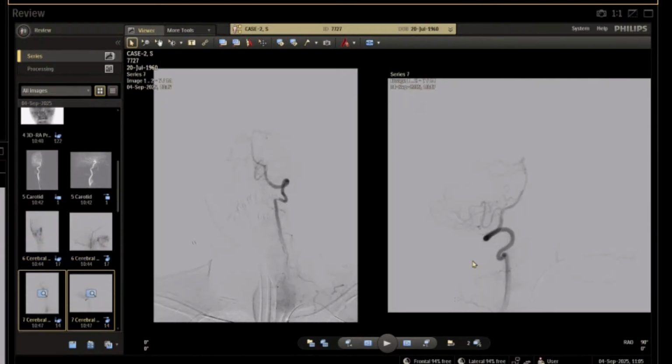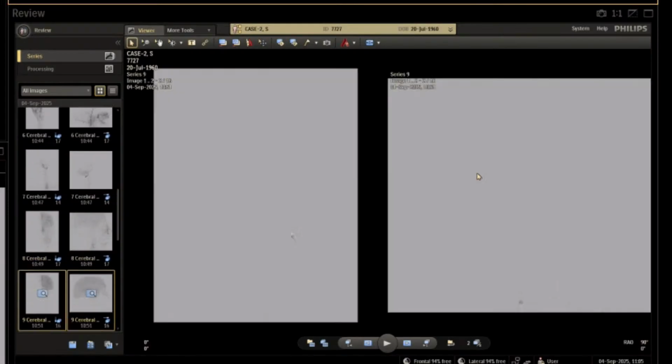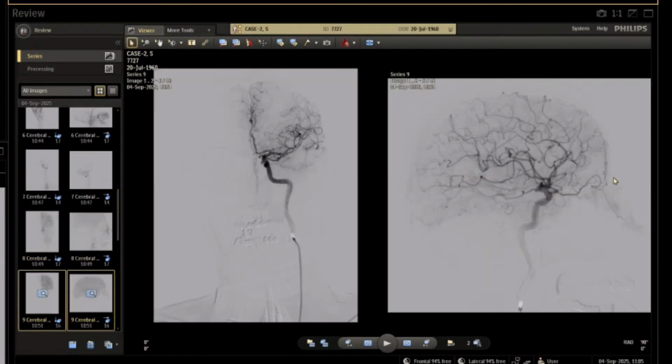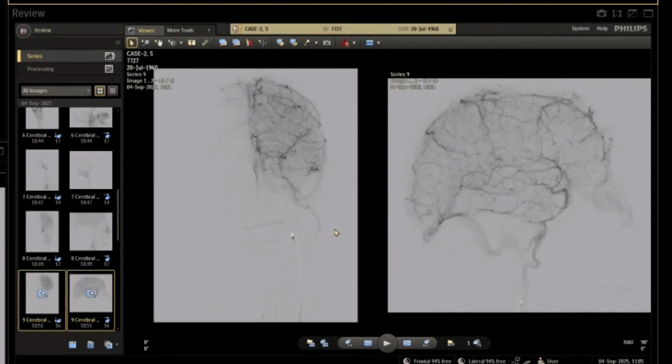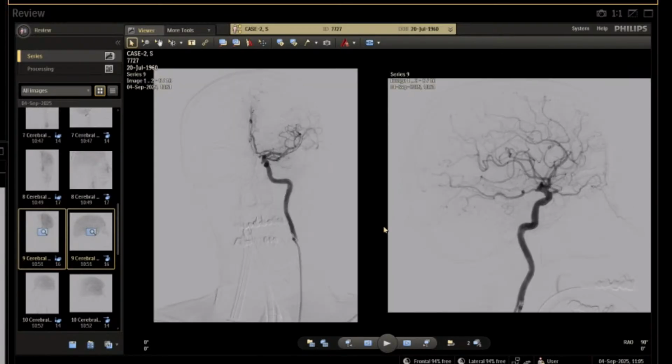The patient has aneurysms on both ICA. This is the biggest one, and the previous one was the smallest. I think we will place an FD. The segment is diseased, and I think it's better to place a flow diverter stent.